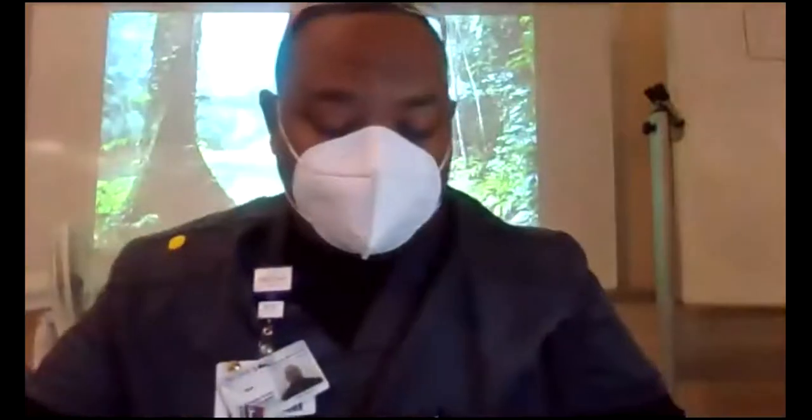See that? This, guys, is a picture of a tracheostomy that has secretions kind of hanging out of it. Now, this is just old secretions, because secretions that come out pour out. There's a lot of secretions when they have sickness and disease. But this is a picture of somebody's tracheostomy in his neck. See how dry that looks? That's dry secretions from lack of humidity. The aerosol bottle was empty when I came in. So I changed the bottle and washed him, made sure he didn't have any issues. But this is what dried secretions look like.